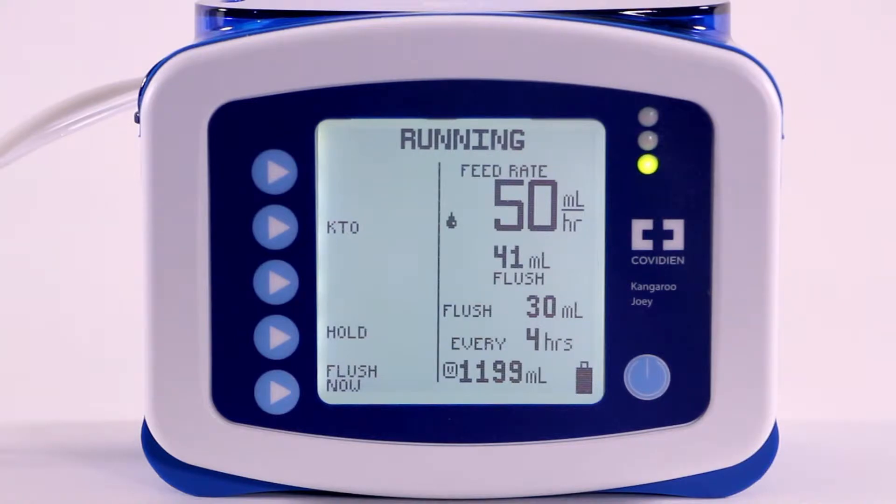The Resume In feature is similar to the Keep Tube Open feature in that it allows for inactive time. Select the Resume In feature and the feeding pump will pause the delivery of feeding nutrition for a pre-programmed time of 30 minutes.